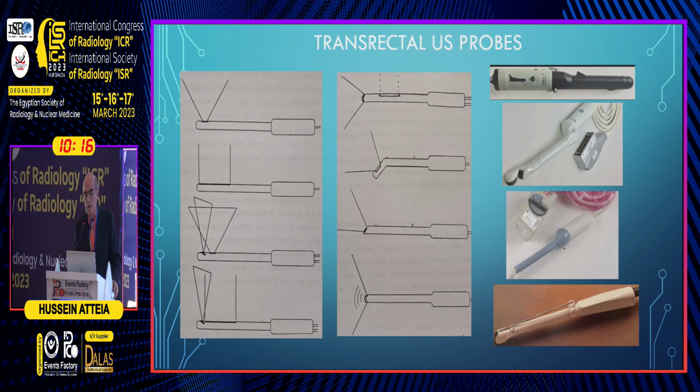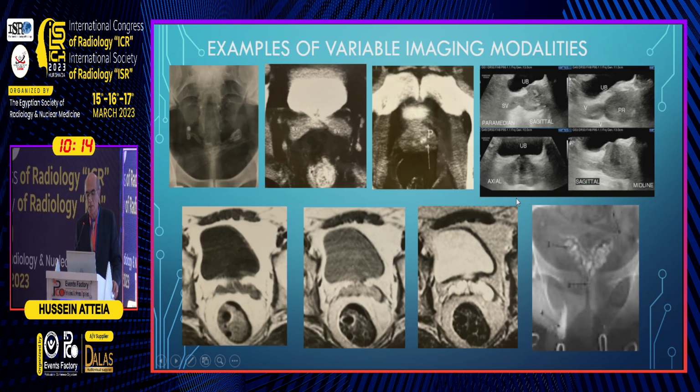Now, this is an example of the one on the left, the seminal vesicle calcifications in a person with azoospermia. Again, the CT in the axial plane at the base, you could see both seminal vesicles readily, a little bit towards the apex, towards the symphysis pubis.